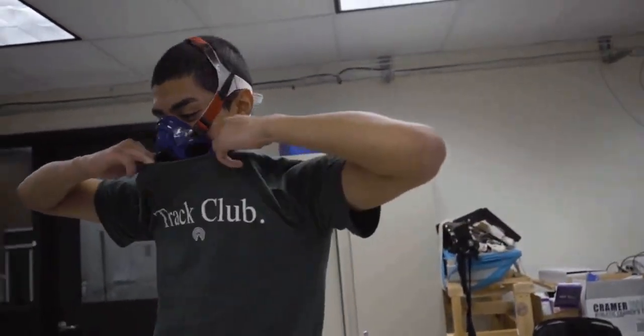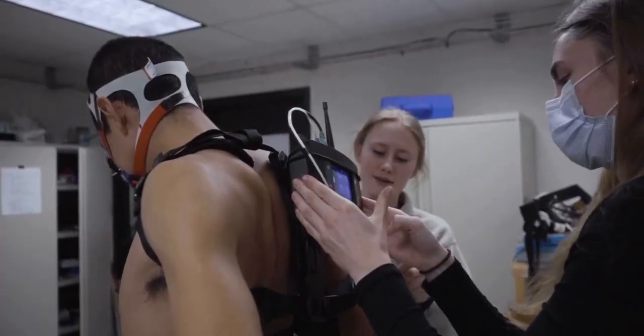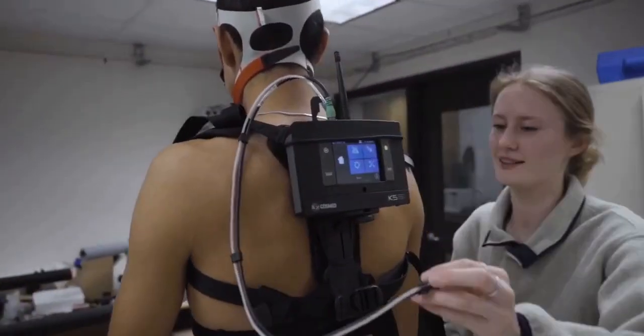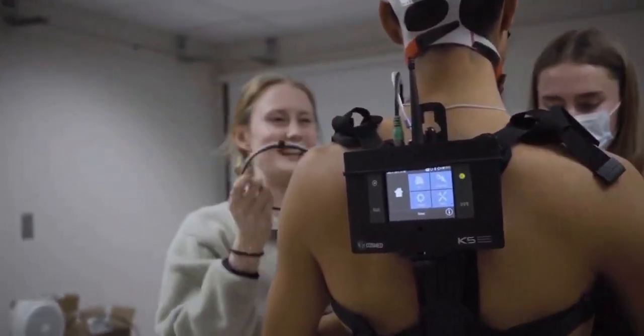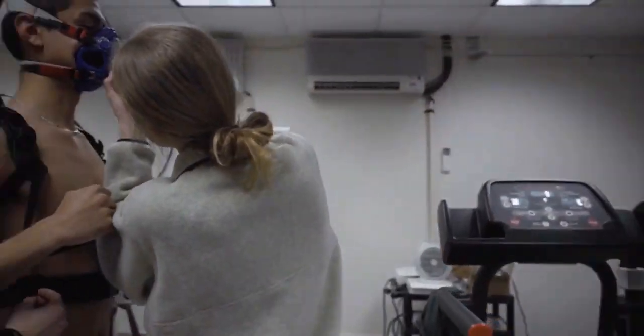So this is our portable metabolic cart — essentially that's the monitor that senses output. How much does this one cost? 70 grand. So if I fall backwards, it's over. Don't fall backwards.